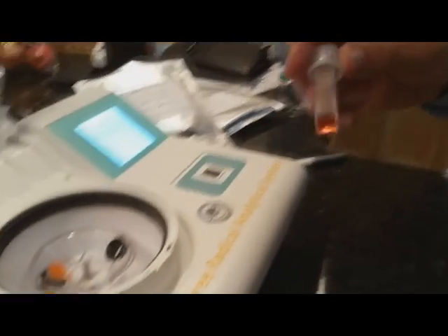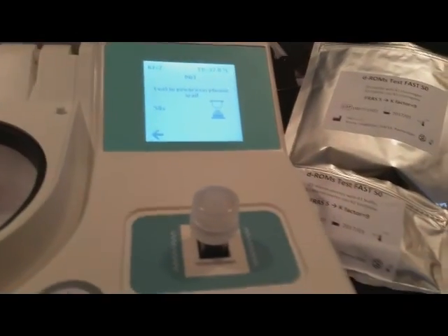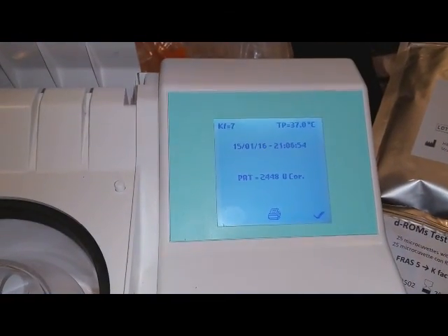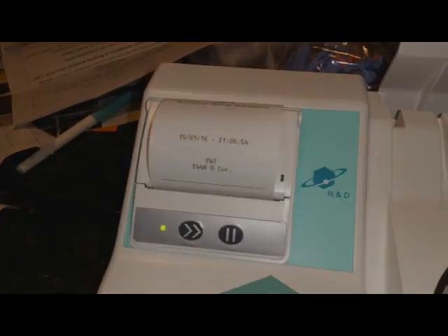Place it in with the ribbed sides going sideways and take a reading that lasts about a minute. The countdown finishes and we've got a PAT reading of 2448 corrected units, and then we get a printout confirming the same result.